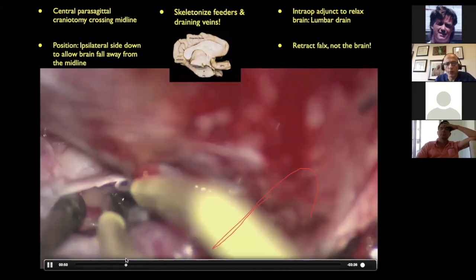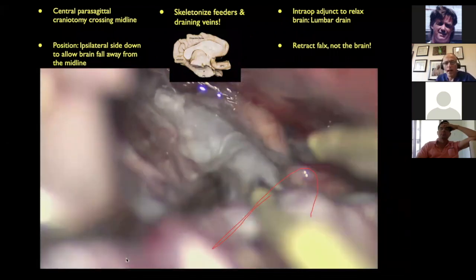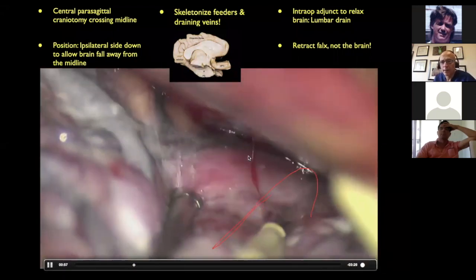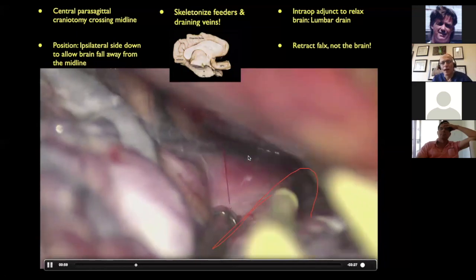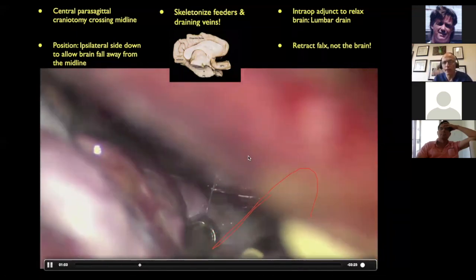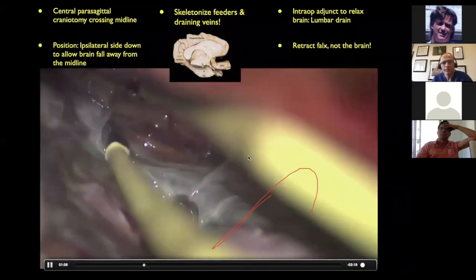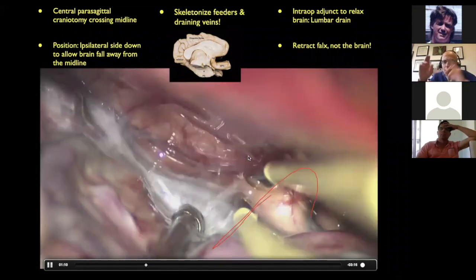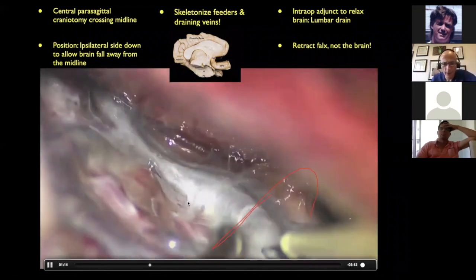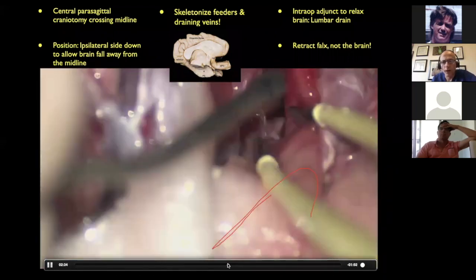And you'll see embolization. Sometimes you think you embolized and you cut these embolized vessels, they bleed. I don't know if they included it in this edition of the video, but when I cut the Onyx vessel, it still bleeds. So when they say, oh, completely embolized, I don't believe it. Okay, anyway, this was a 12 hour long surgery.